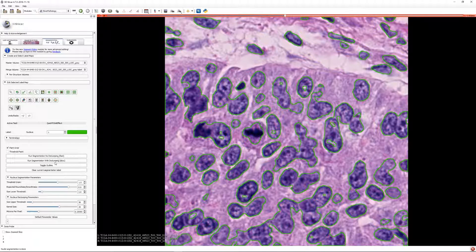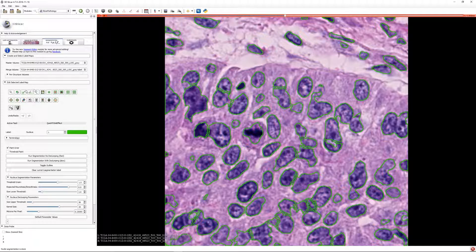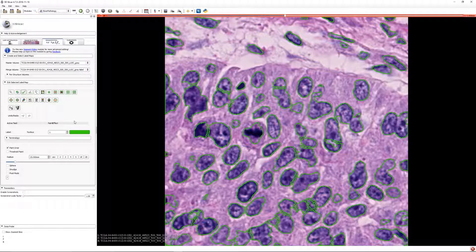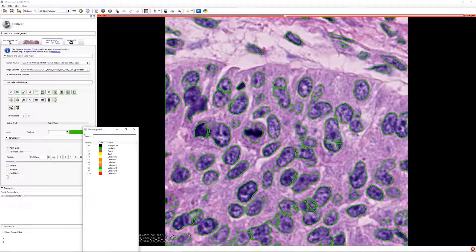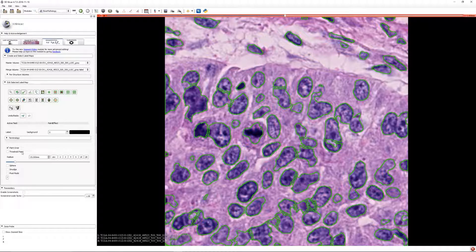Slicer Pathology allows iterative, interactive adjustment of segmentation algorithm parameters to optimize results within a visualized region. The selected parameters can then be applied to regions, allowing a nimble, semi-automated way to create a high-quality nuclear segmentation across an entire slide.